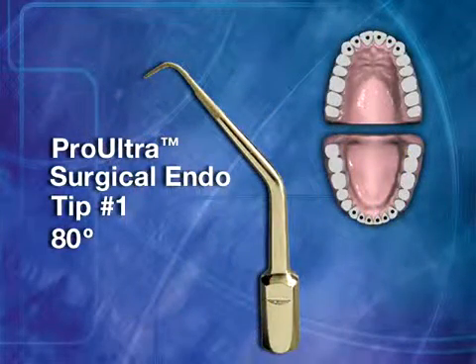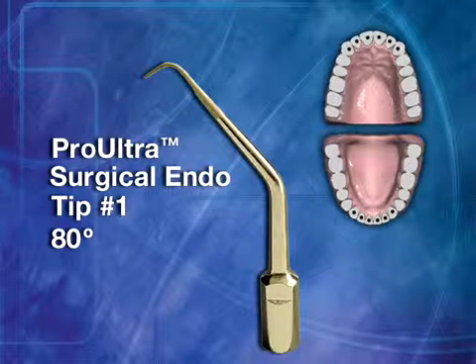Surgical Tip No. 1 has an 80-degree tip angle. This is a universal instrument designed for anterior roots.